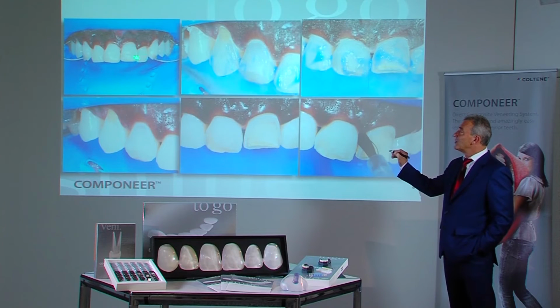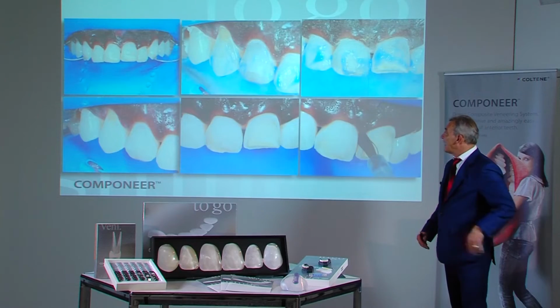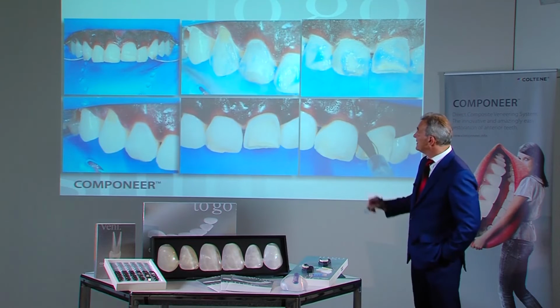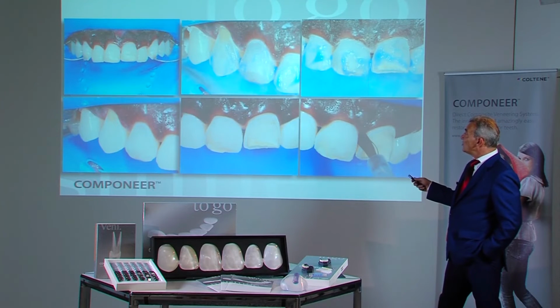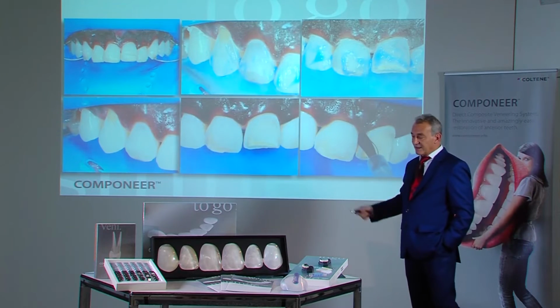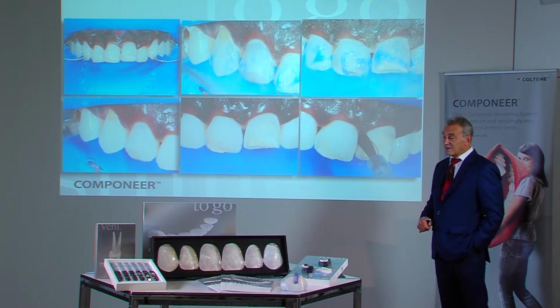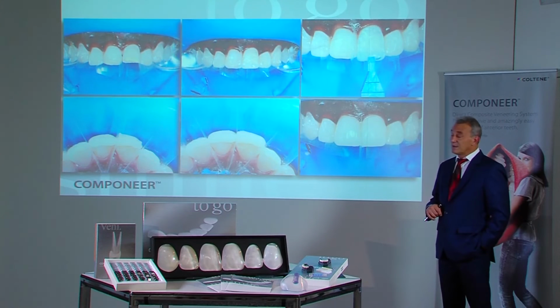We therefore treated the teeth and removed the old composite. Here we can again see how etching and bonding is performed, as described in the introductory chapter. Etching was omitted in the critical areas where one was not sure whether this was dentine or enamel. Like in this cervical dentine area. Enamel was only etched where one was 100% positive. In the critical areas, be they interdental or cervical, one applied one-coat bond self-etch prime and bond primer, as it etches dentine reliably and also allows treating the tooth enamel. This way, we can be sure that bonding took place both in the cervical or interdental area.